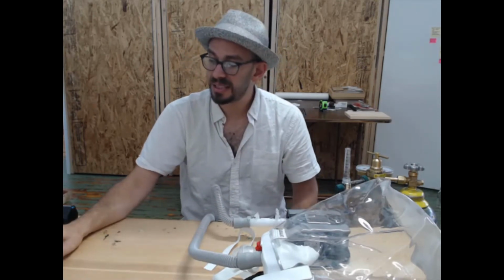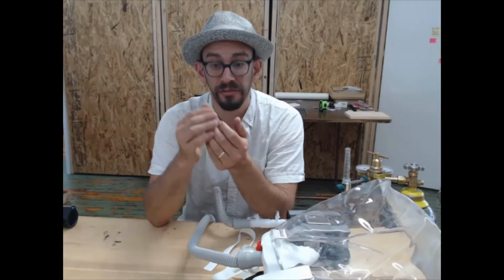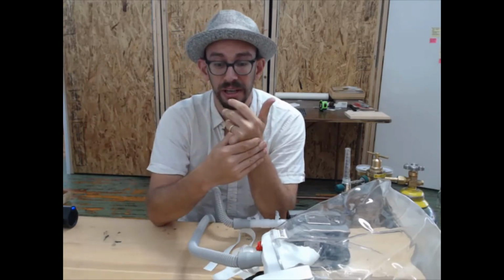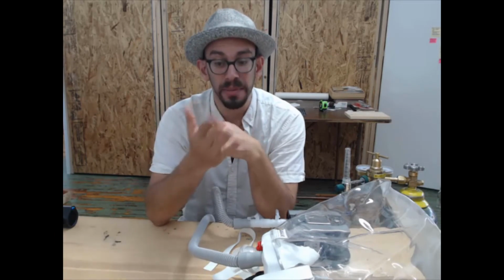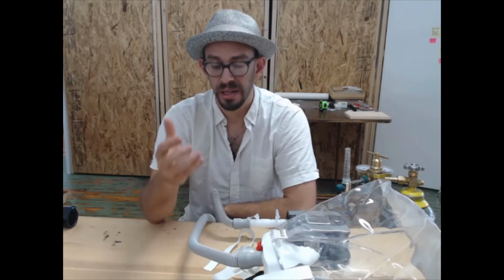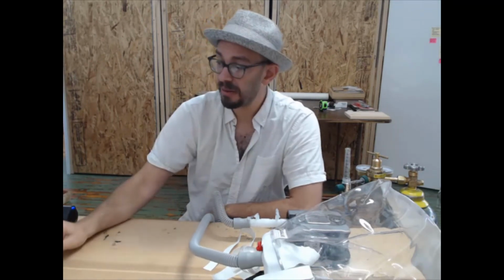So as long as you are working within the range of this table, you are going to deliver at least 50 liters a minute of flow, and this should be a guide. If you go outside of this, it can go into a scenario for the patient where they're rebreathing exhaled CO2, and that can be dangerous for them. So please ensure that you are setting up the patient circuit properly and you are delivering the right amount of flow and the right amount of pressure to the patient from this operating table.